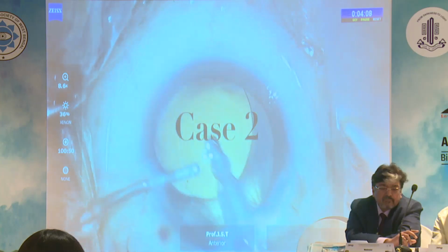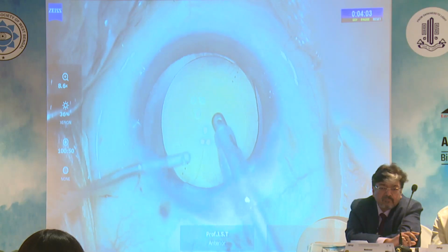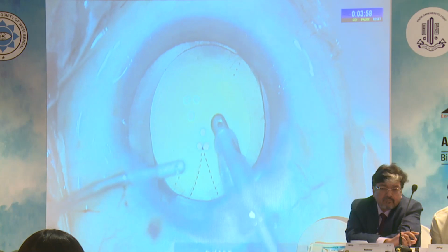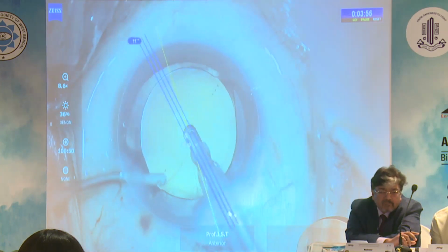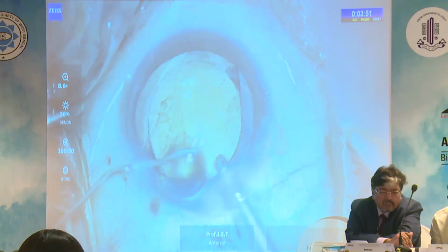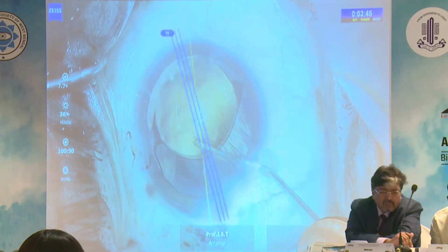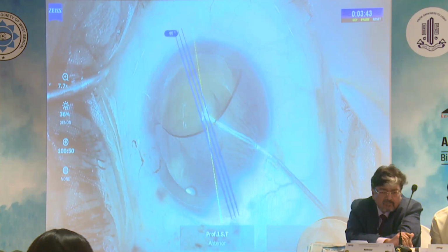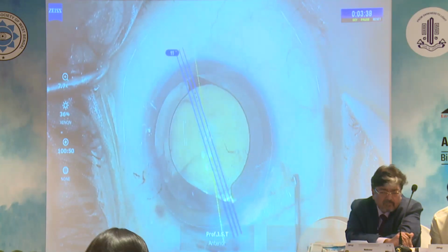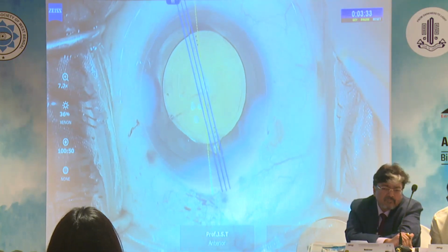In this case, planned for a phacoemulsification with toric IOL implantation, a small triangular shaped PCR was observed after implantation of the IOL during the OVD aspiration. The second instrument was removed first, followed by the injection of OVD to maintain the chamber. Visco-dispersive OVD was injected in the areas of PCR beneath the IOL to cushion the anterior vitreous face. The intraocular lens was then aligned along the correct axis and left in the capsular bag.